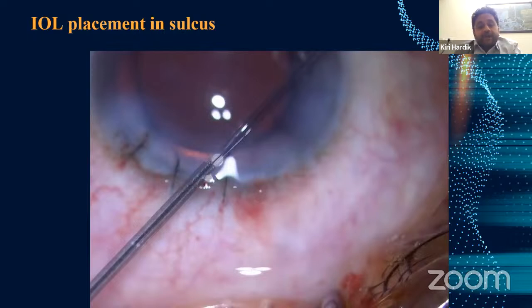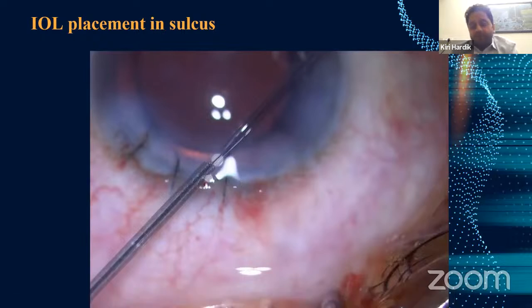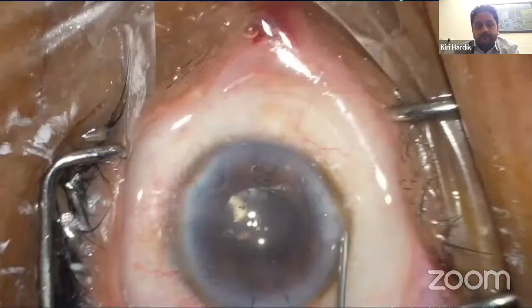So while giving the peribulbar block and while doing the massage, the pressure can get raised and your old wound can open. So it is always better to put sutures in cases of complications, or when there is a posterior capsular rupture, when there is a nucleus drop, when there is an IOL drop, or when the patient is aphakic.